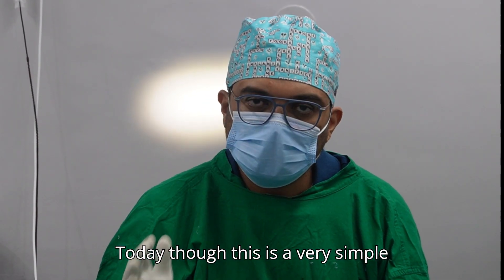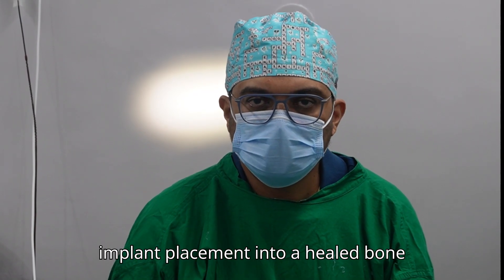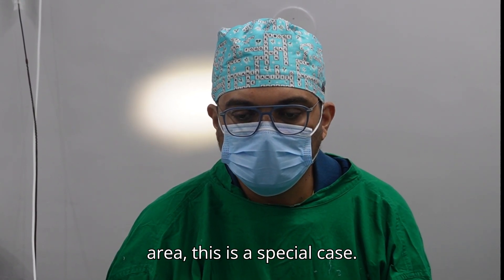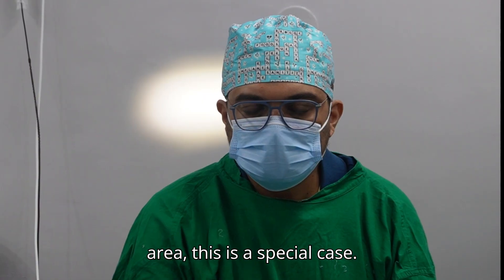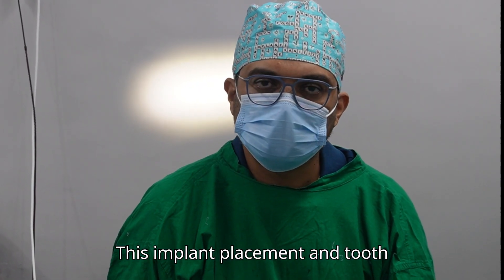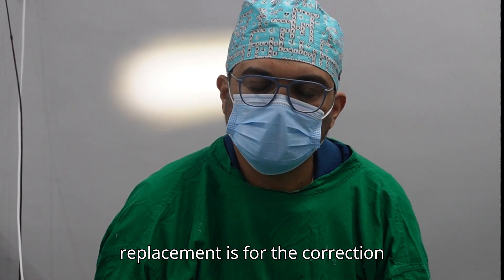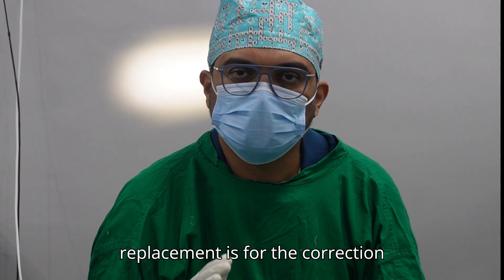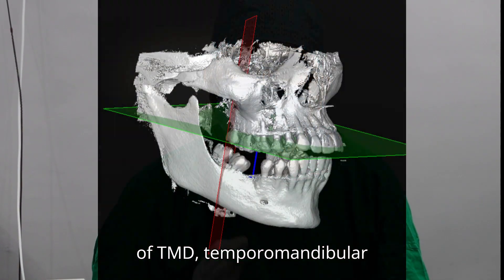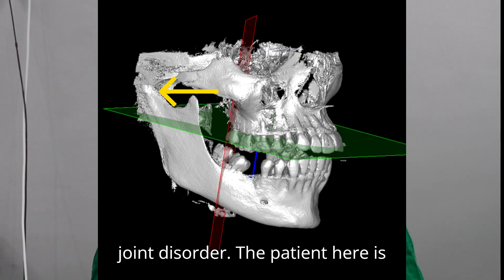Today, though this is a very simple implant placement into a healed bone area, this is a special case. This implant placement and tooth replacement is for the correction of TMD — temporomandibular joint disorder.